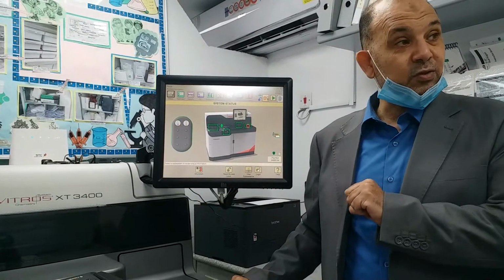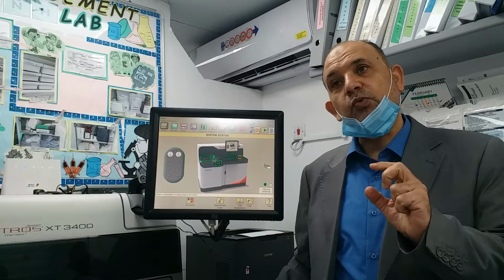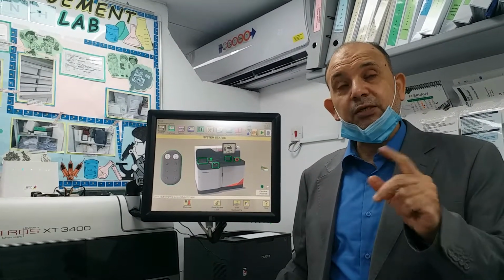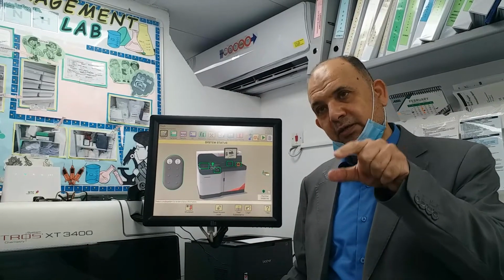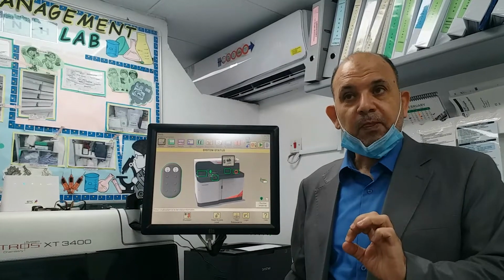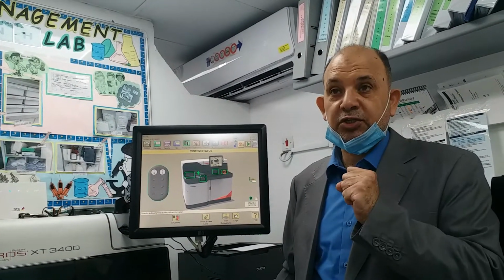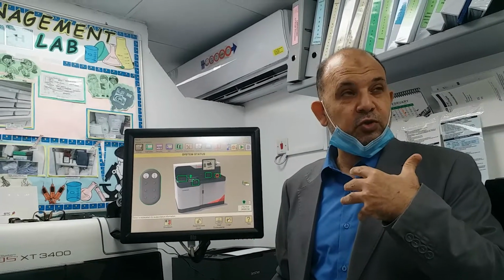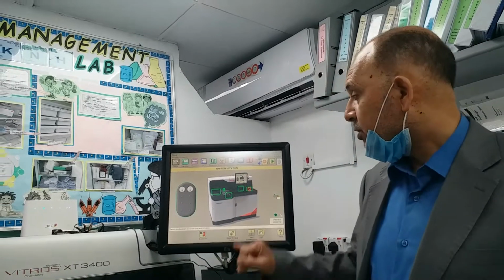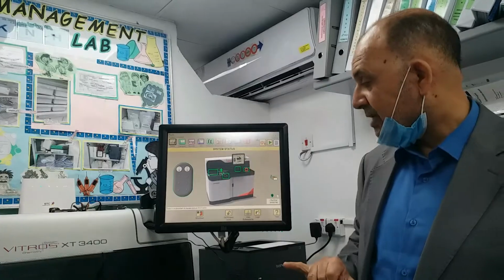That means it has the facility to work with quality control and a lot of things in sample editing and reading, but it will not be related to the diagnostic. Diagnostic is something special for the engineer. Because of that, this password is not going to change anything in the engineer facility or engineer requirement.